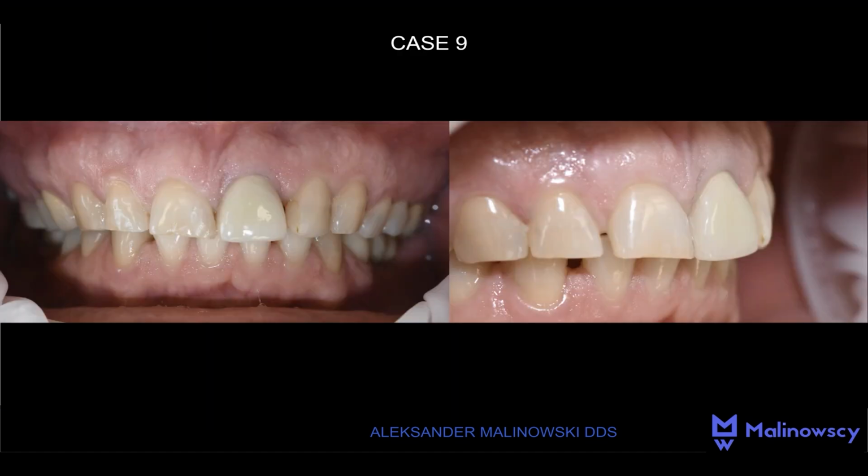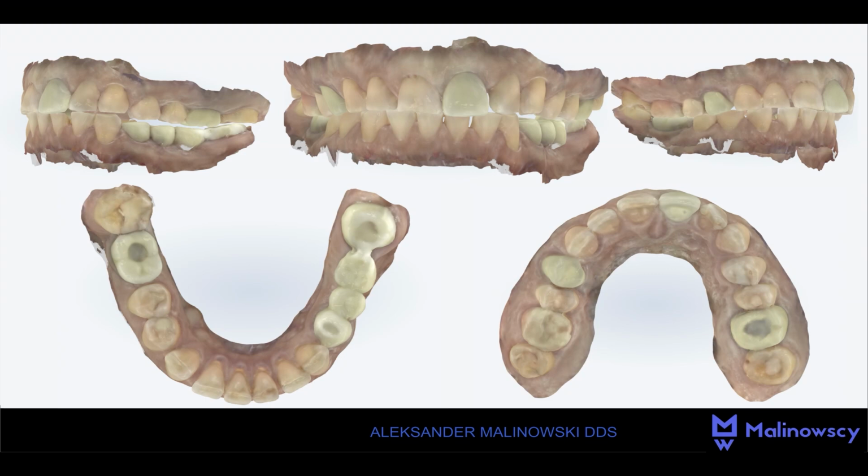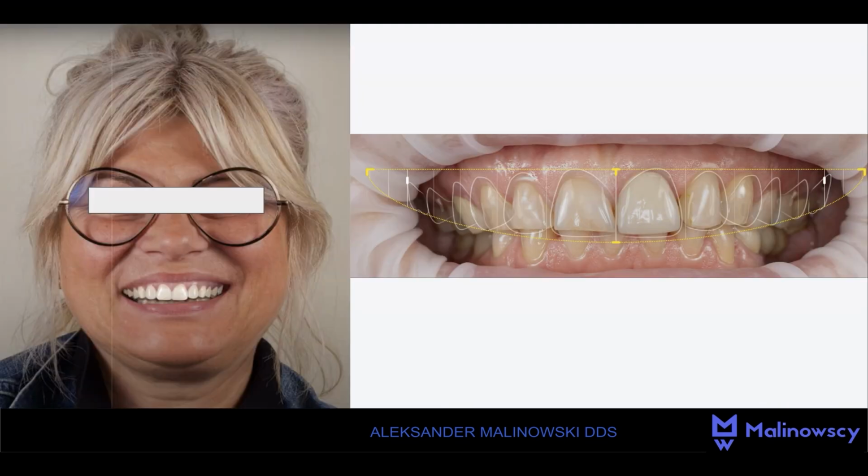Okay. Here we can see the intraoral photographs. Please, these are the intraoral scans. Please notice that even in habitual occlusion, the patient does not have evenly distributed bilateral occlusion. I wonder if this situation developed over time or the bridge was poorly made from the beginning. Nonetheless, the fact remains that the patient had to shift her jaw to the right every single time she wanted to bite down. We designed the smile in the program according to the principles of DSD.